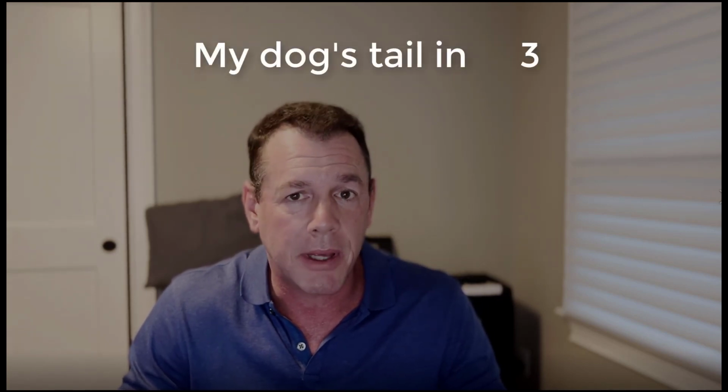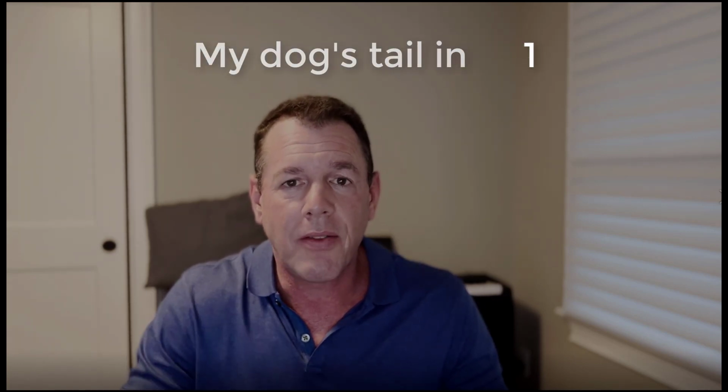And over the years, I've been pretty much focused on creating content that will help doctors and team members maximize the applications within our software, and then translate that to the absolute best patient experience and absolute best patient outcomes. So this video is for the doctors. I train a ton of you on using our 3D software.